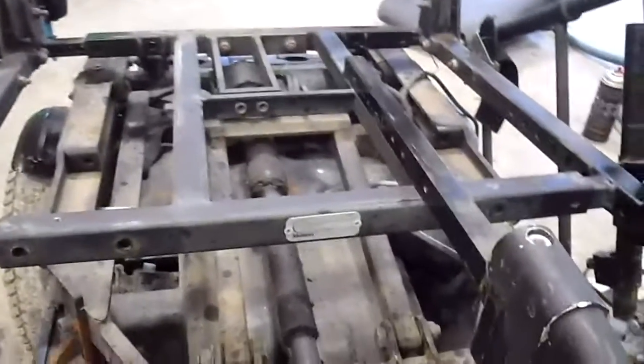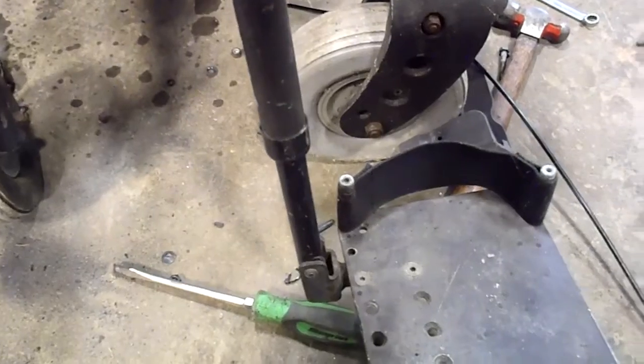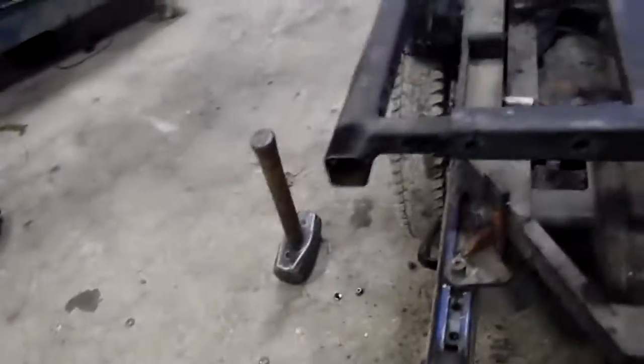Anyway, sorry, distraction. I could probably just put a mount in there, and then they would still be adjustable, but they'd be inside. I'd have to make sure it cleared the wheel, or possibly like this, like I was talking, having one. Anyway, I'll figure that out later. Those are there. So when you see people talking about custom fitting wheelchairs, these are really cool how they make them totally adjustable. It's super basic stuff, though.